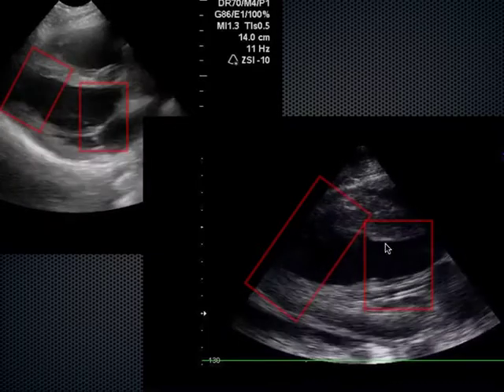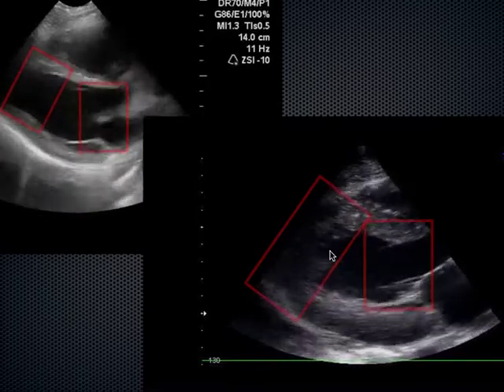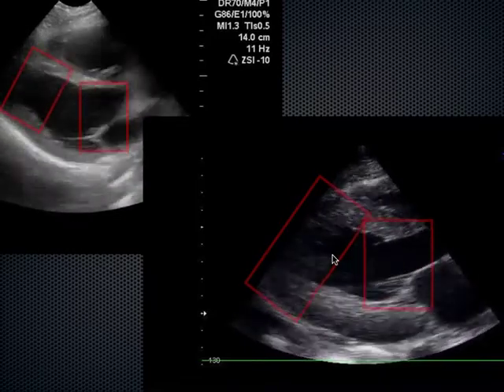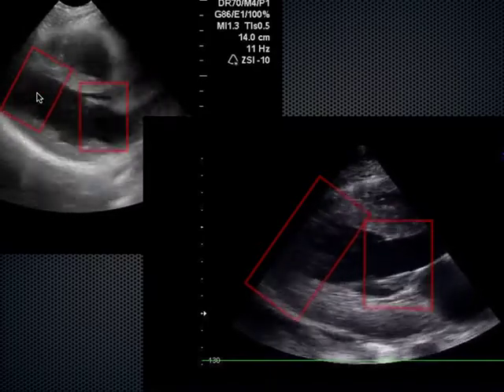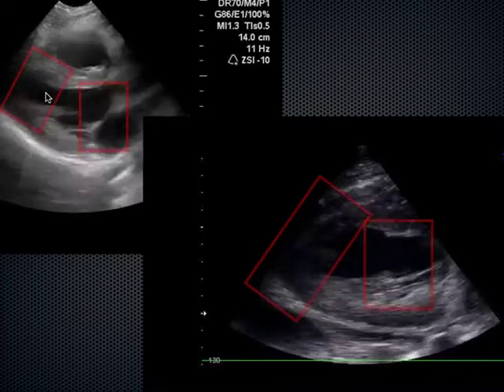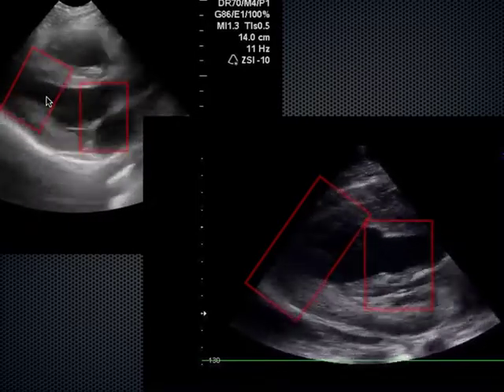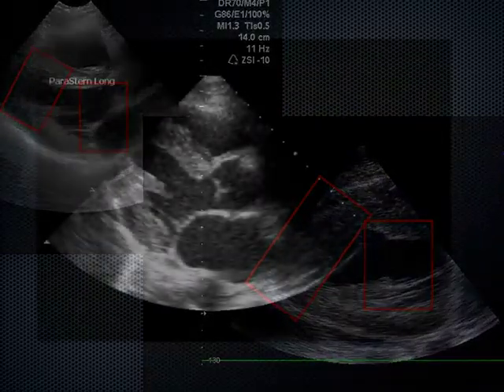The second problem is that we see back here in this left ventricle, if we're an imaginary red blood cell sitting right here, we don't make out very well that this interventricular septum and this posterior wall are coming together to any meaningful degree the way it is over here. You can see up here there's a pretty good delta in the chamber sizes between end systole and end diastole. There's a good difference in that chamber size because the interventricular septum and posterior wall are really squeezing together really well. And so right off the bat, we look at this heart and we go, okay, definitely decreased LV function. Now let's apply that to this heart here.